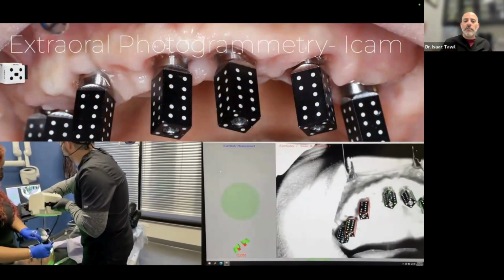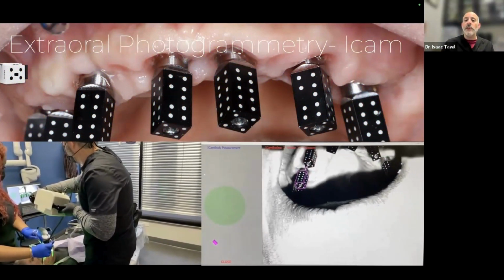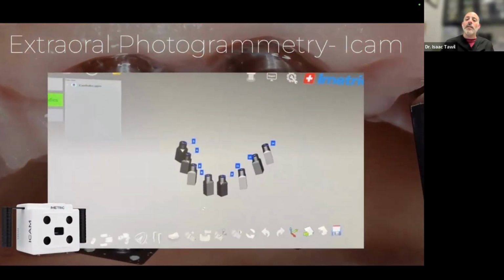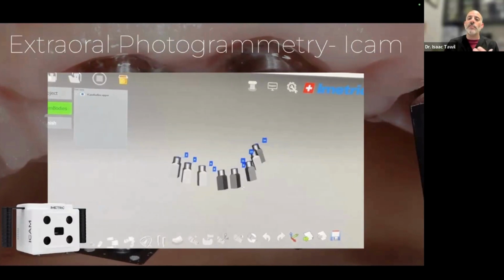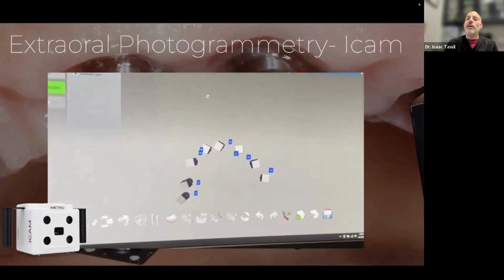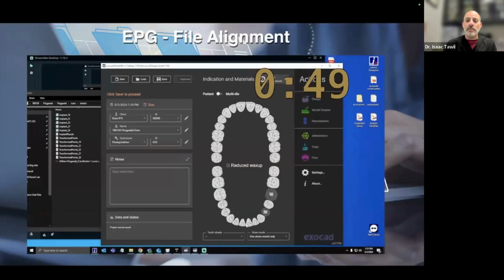This object is a little bit heavy, and I'm trying to link everything up, but eventually I can get it, and eventually it will give me a data output that can be quite accurate. And now I can take these 8 implants and start to make my design once I have converted all these files and matched them together. This conversion and matching and file alignment can take some time. This is not seconds, this is in minutes.